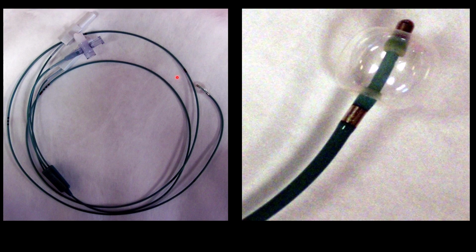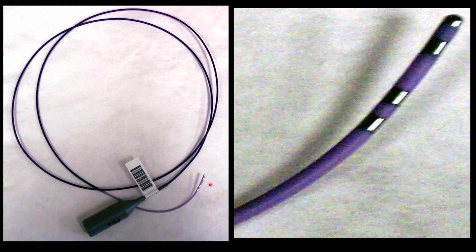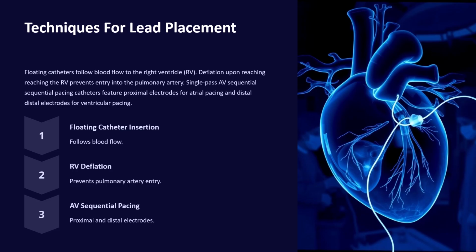Here is the floating, or balloon-tipped, pacemaker, which is inserted the same way as a Swan-Ganz and is used if there is no fluoroscopy. The semi-rigid catheter is stiff and is easily manipulated with fluoroscopy.